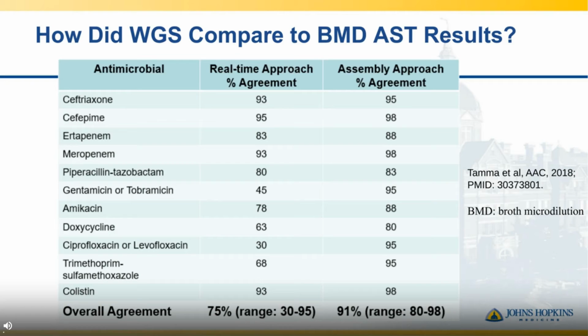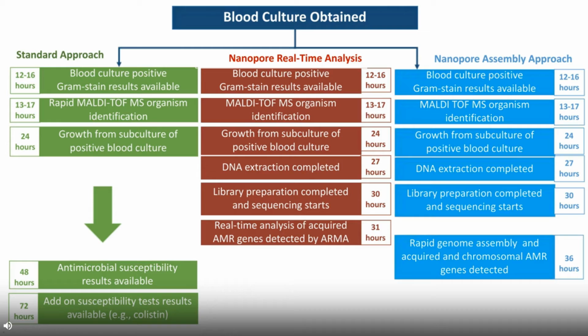And so this shows us that even though there's a higher error rate with nanopore, you can use bioinformatics tools to overcome that error rate to allow us to apply this methodology to make a difference clinically, where we can have these results in a clinically applicable time.